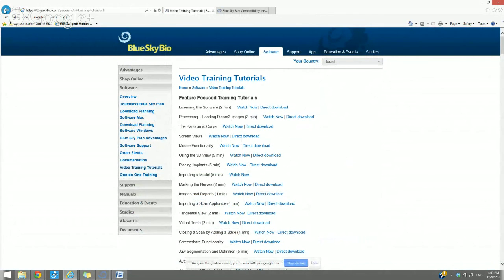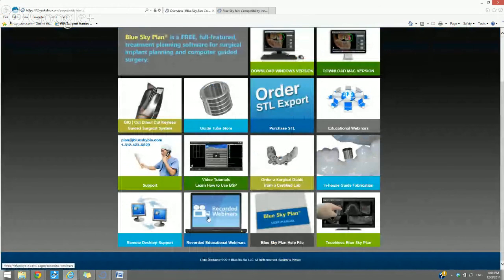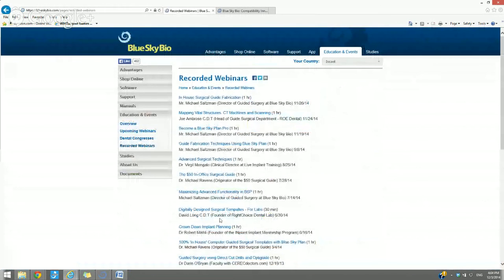We also have recorded webinar presentations. We have a list of them, which you can access through here. We have them on learning the software, on guide fabrication, on clinical treatment planning, on advanced surgical techniques. So this is a very good resource as well.